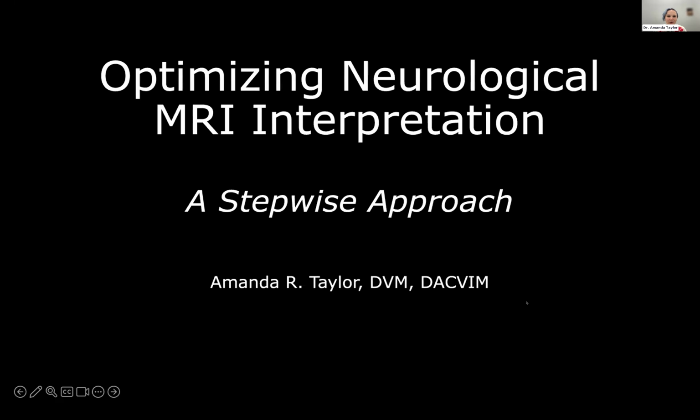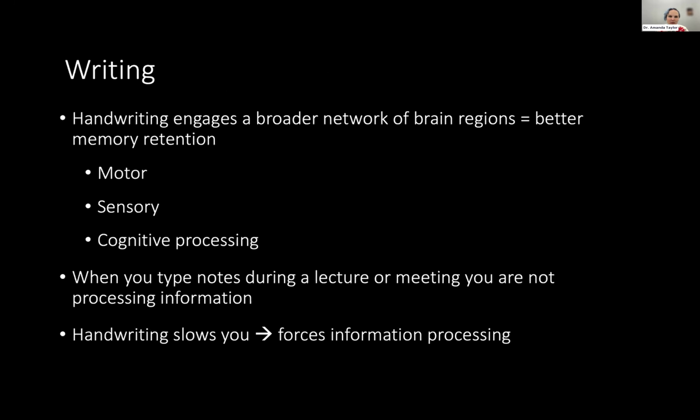So excited to be here today to talk to y'all about optimizing neurological MRI presentation interpretations. It is something that I'm rather passionate about, and having trained residents and students for quite some time, I have seen people struggle with this quite a bit, especially when they're used to being in an institution where everything is read by a radiologist, and then suddenly they're in a practice where there's not a radiologist who reads their scans. So hopefully you'll find this helpful as you approach MRI interpretations in the future.